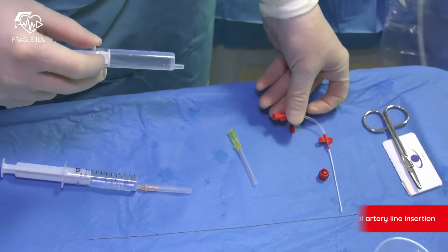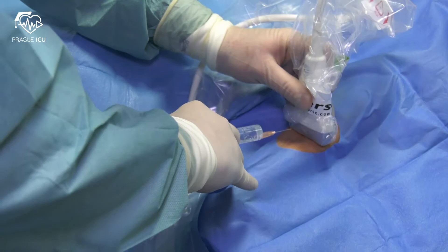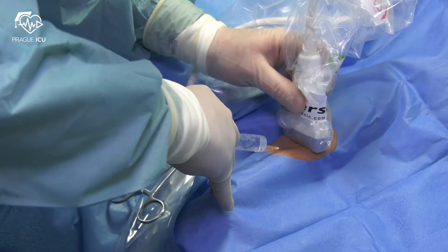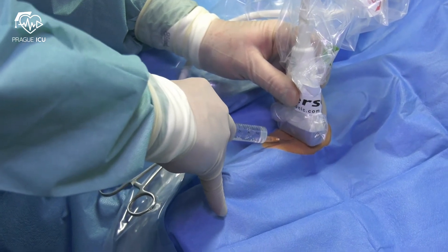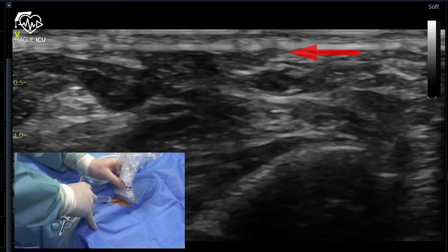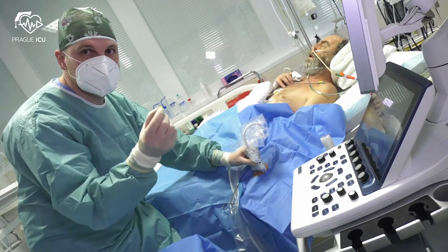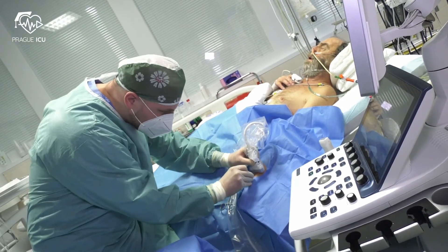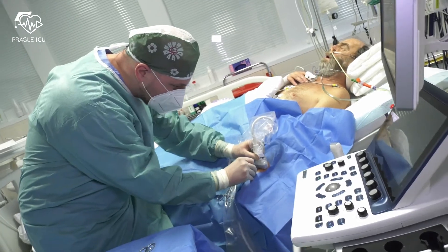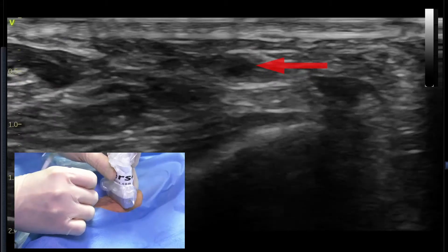Flush the needle and the catheter. Firmly fix the probe on the patient's hand. Ultrasound-guided cannulation of the radial artery is best performed in the short axis view. Apply 2–3 milliliters of an anesthetic while watching the needle on the ultrasound. Keep the probe firmly placed at the same spot all the time.